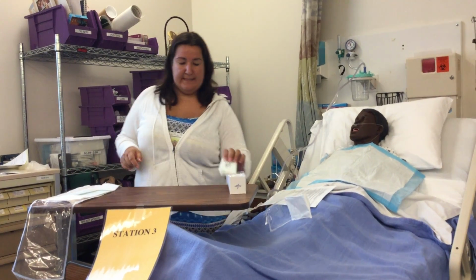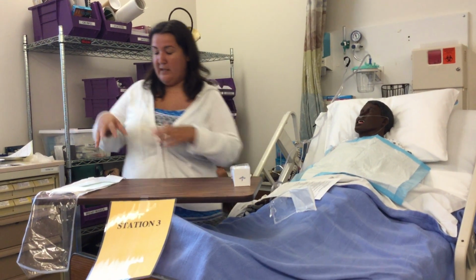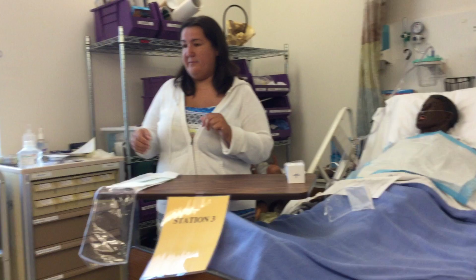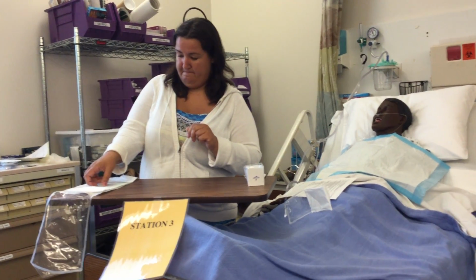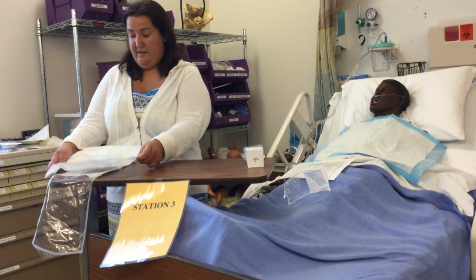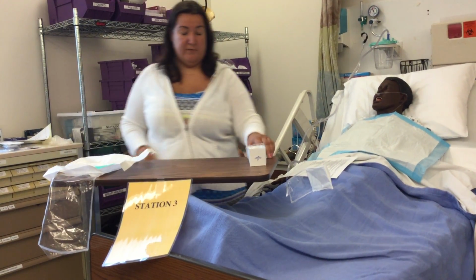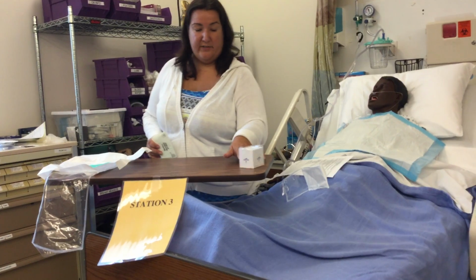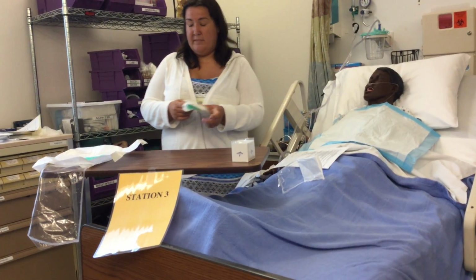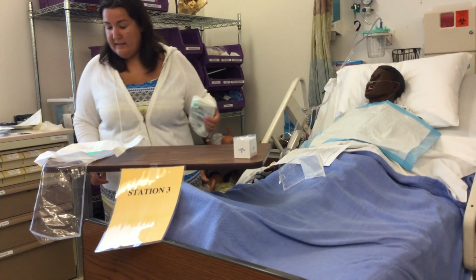I want to open this thing up now, before I open my gloves. You could also touch it with your sterile gloves, so either way, or you could have it open and ready for you. It's up to you how you want to do it. Just be careful with it. If you're using the gloves in here, then your gloves will be upside down here. If you're using another pair, be careful when opening this not to contaminate your sterile field. And those are medium, so if you are medium, then that's fine. And I have it upside down.